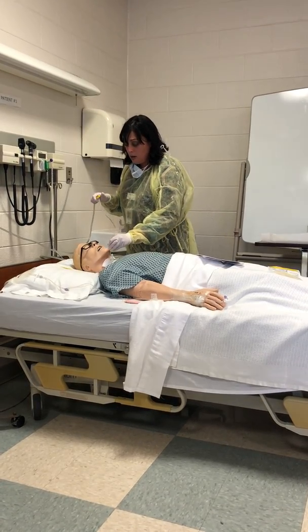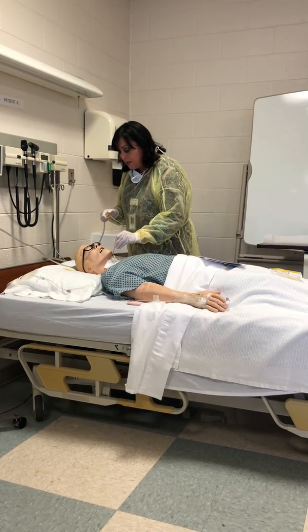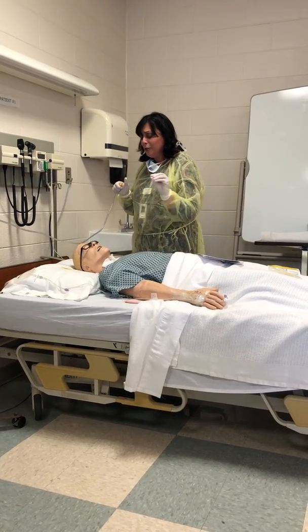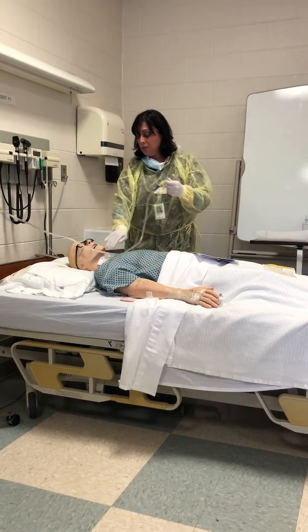All right, you ready? Let's go. Good. All right, got resistance. He's coughing. So turn it and intermittently suction on the way out. I'm sorry, I'm suctioning, turning. Okay. How are you feeling now? Oh, that's better. Okay, let's put some oxygen back there.